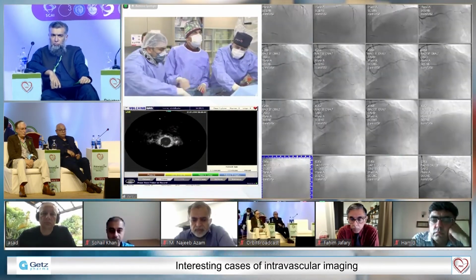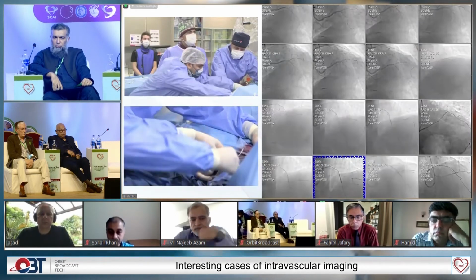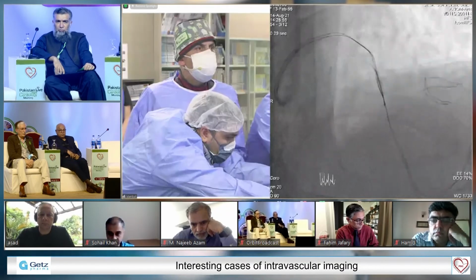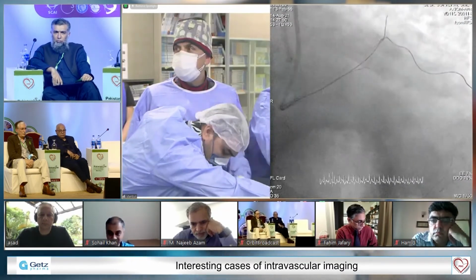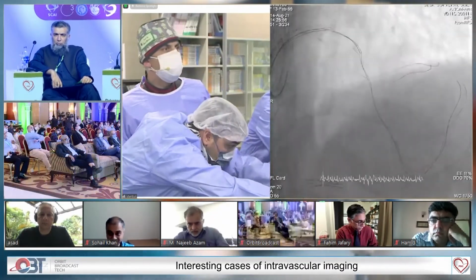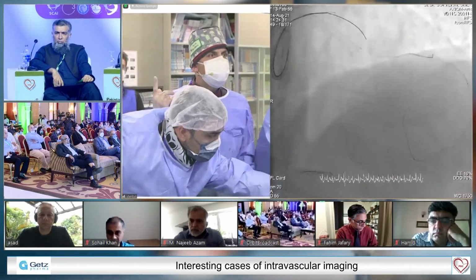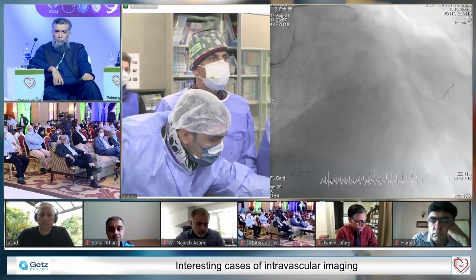Now I'll show you where we are. As you remember, we tried to go searching for septal, so for epicardial collateral.